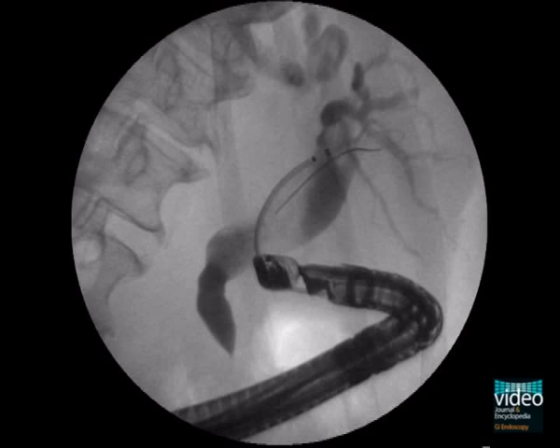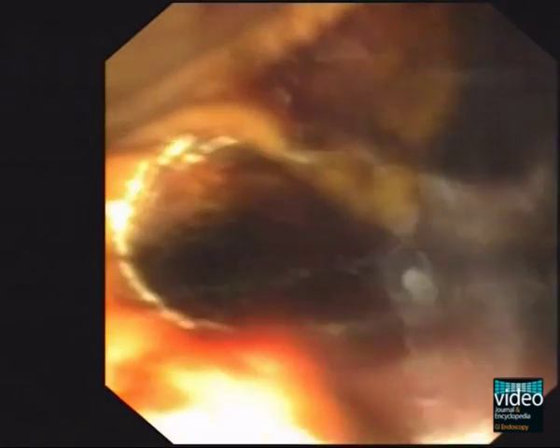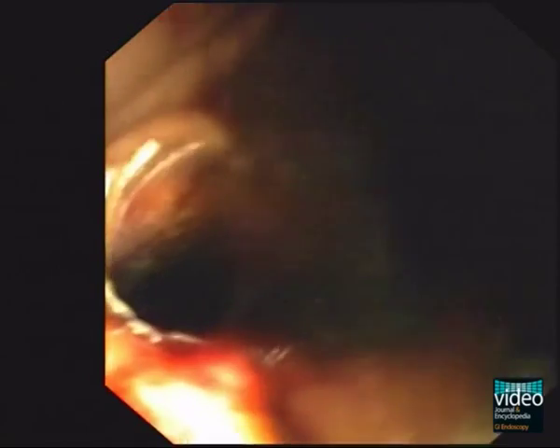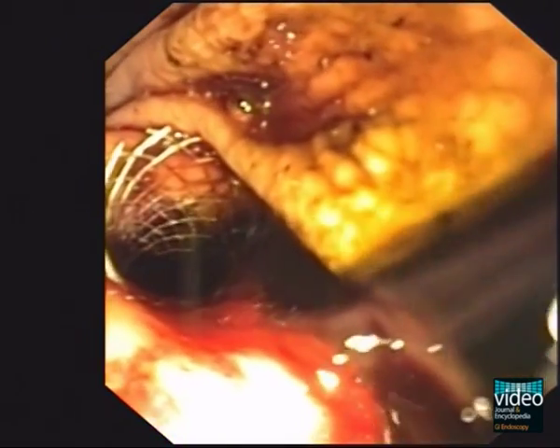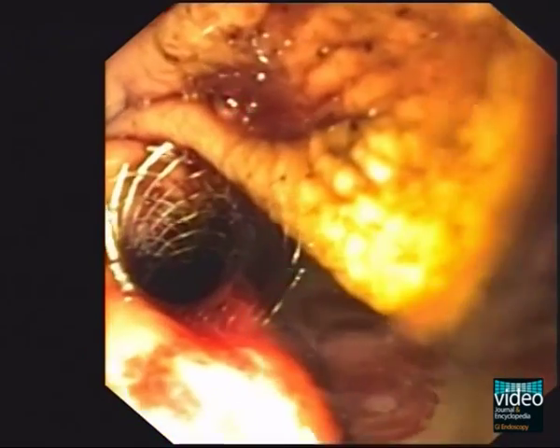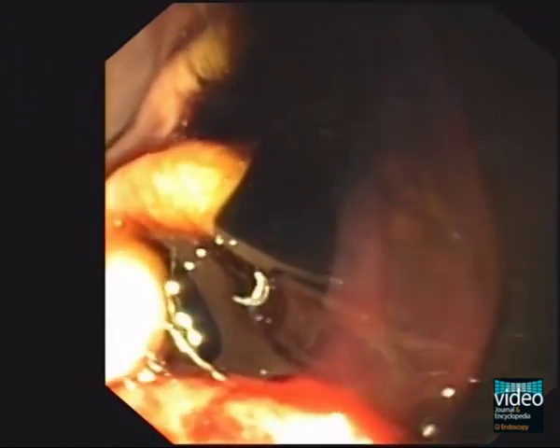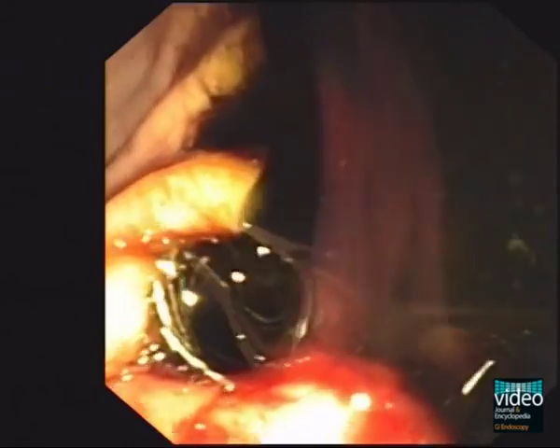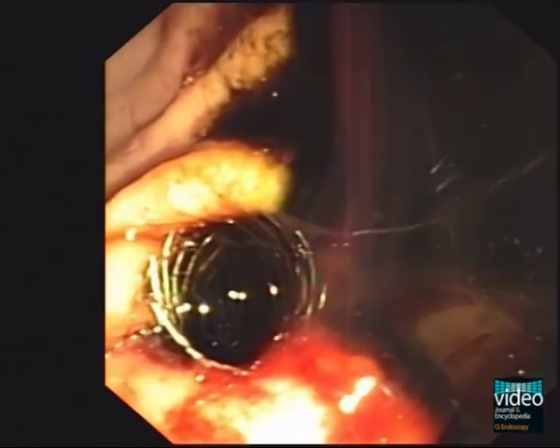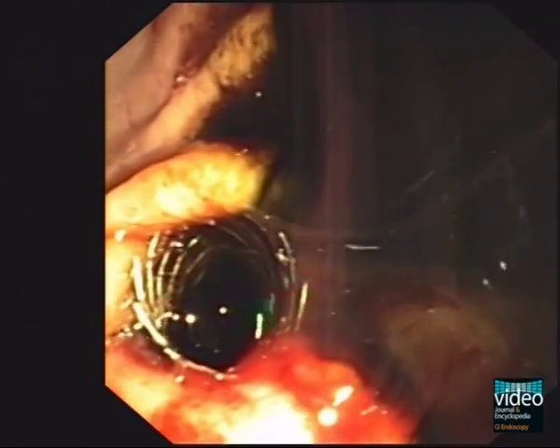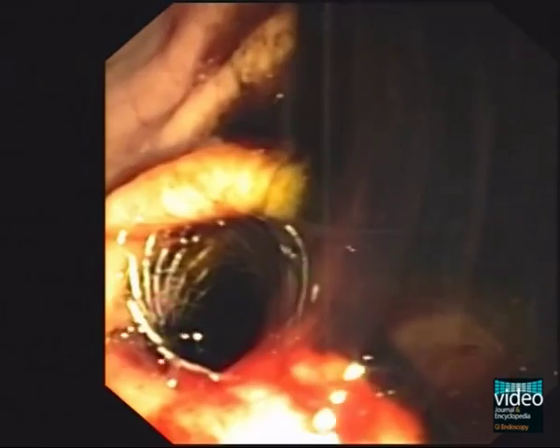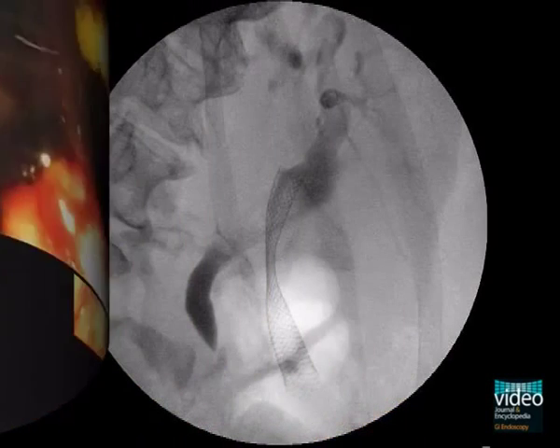The stent delivery system, armed with a fully covered metal stent, is pushed over the guidewire. The delivery starts when the stent is positioned near the bifurcation of the biliary system. Here you see the endoscopic control during stent delivery. The favourable position of the intra-duodenal part of the stent should be nearly 1.5 to 2 cm within the duodenal cavity.